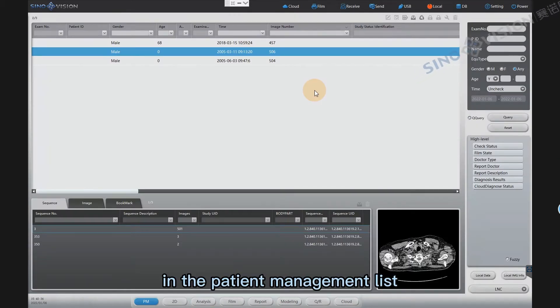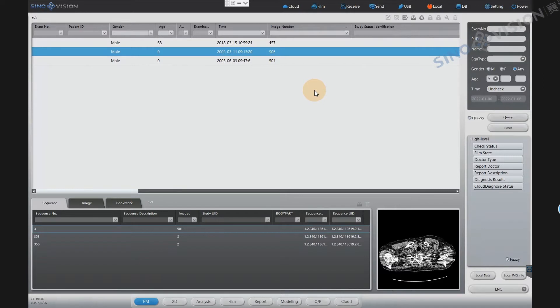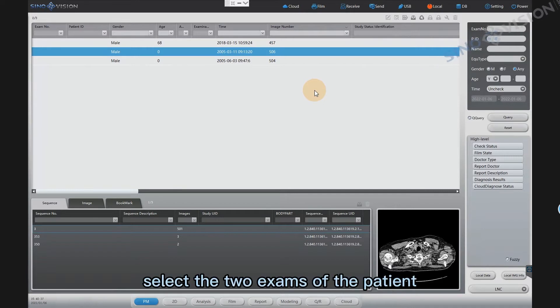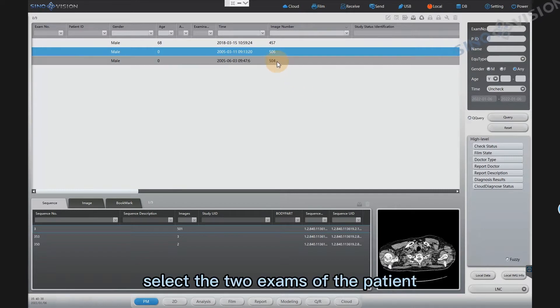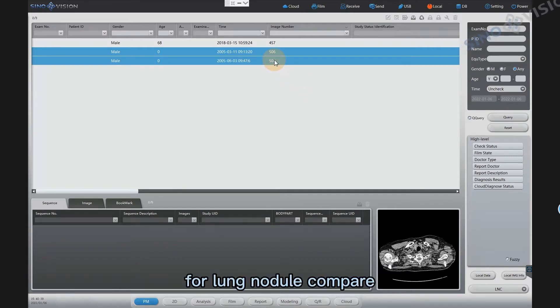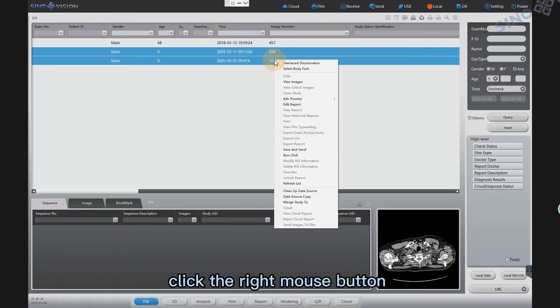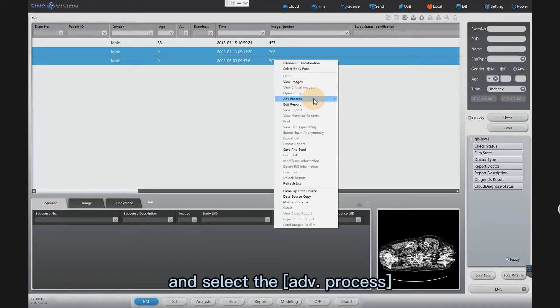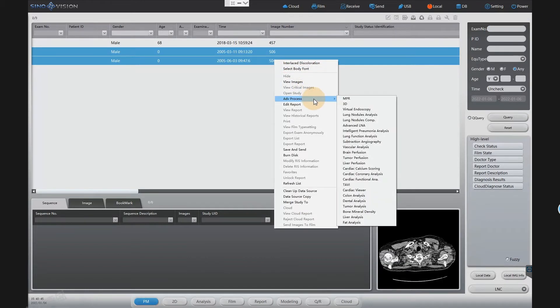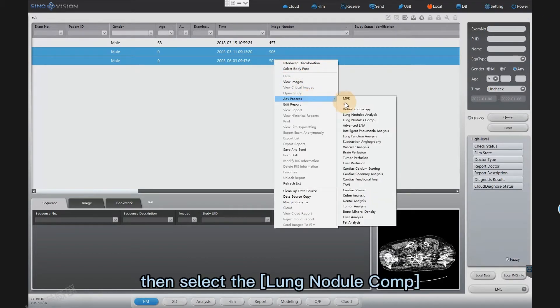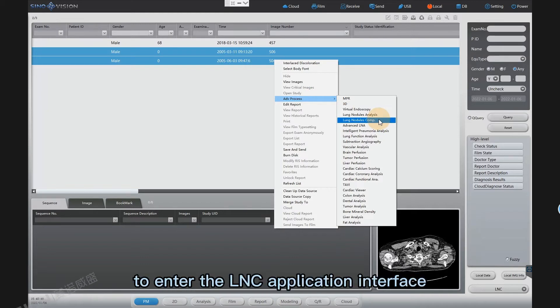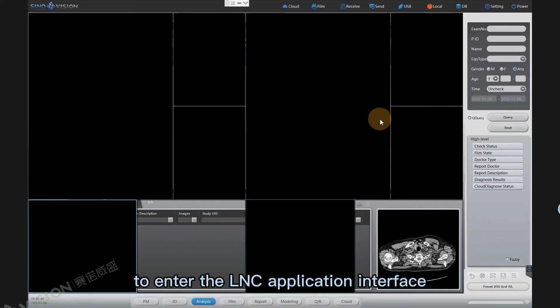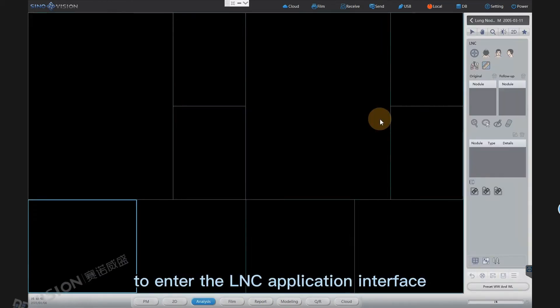In the patient management list, select the two exams of the patient for lung nodule compare. Click the right mouse button and select ADV Process, then select Lung Nodule Comp to enter the LNC application interface.